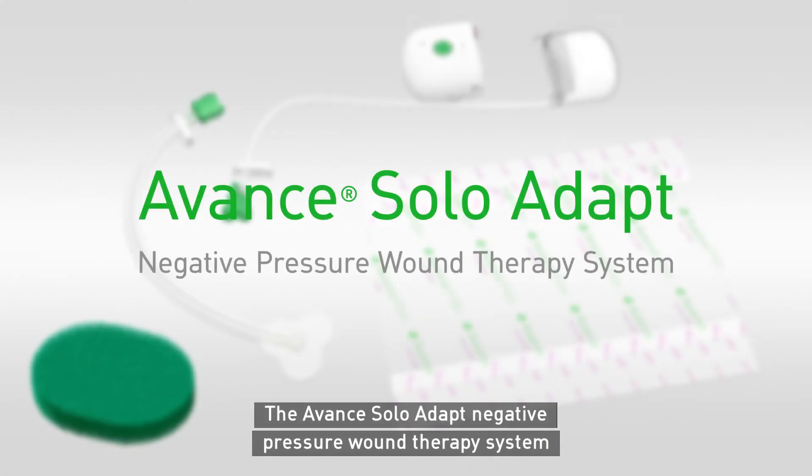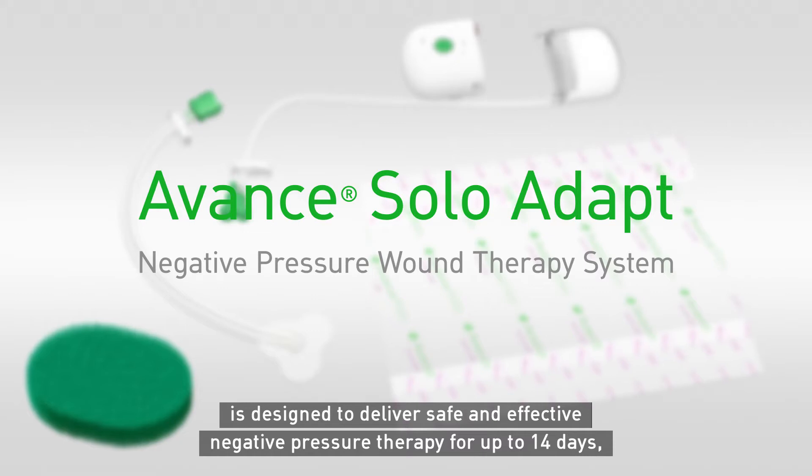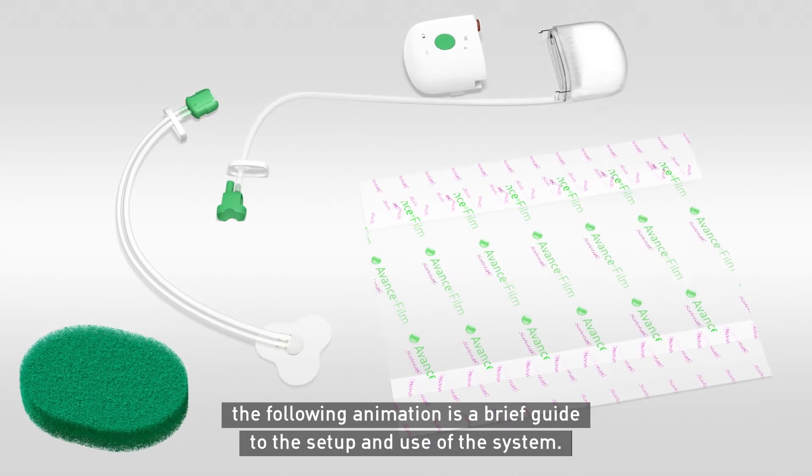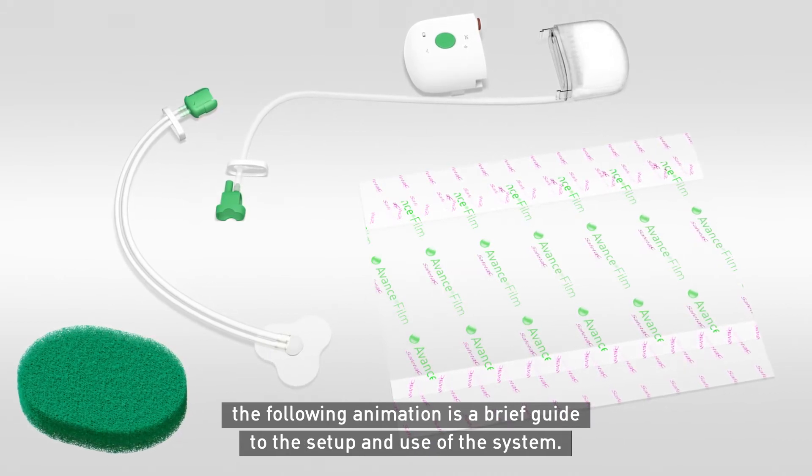The Avance Solo Adapt Negative Pressure Wound Therapy System is designed to deliver safe and effective negative pressure therapy for up to 14 days. The following animation is a brief guide to the setup and use of the system.